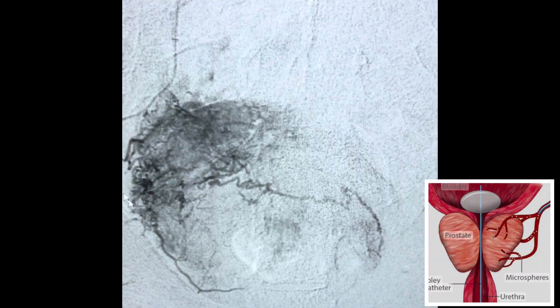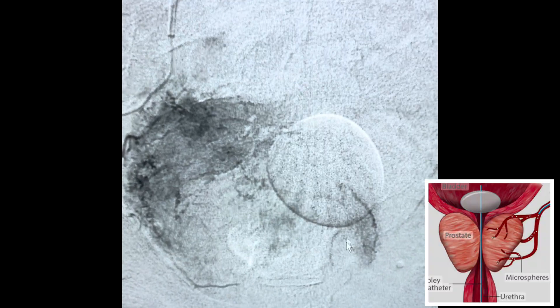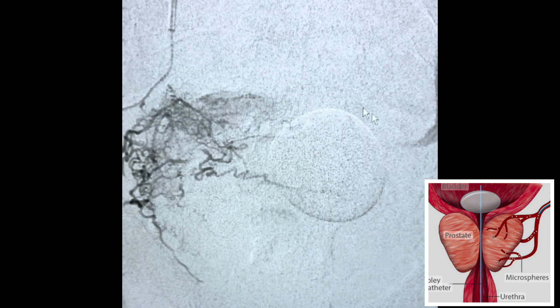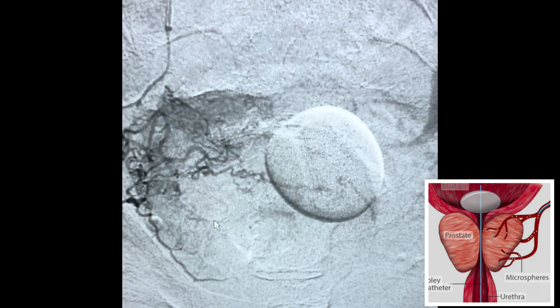You can see this is the prostatic gland here with all of the vessels supplying the prostate gland, and again, the Foley catheter is being demonstrated here.